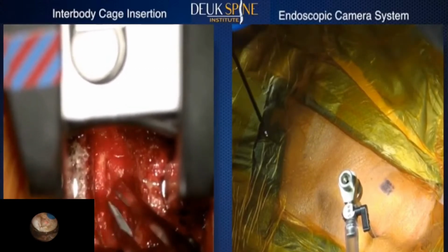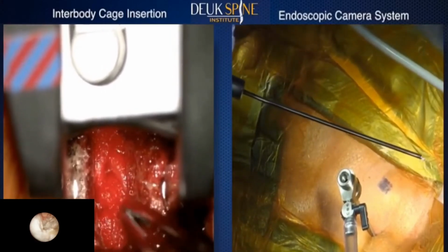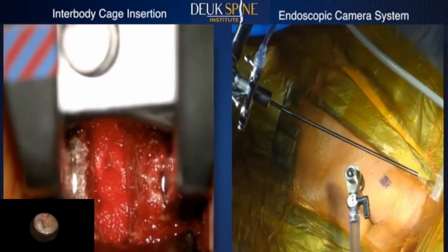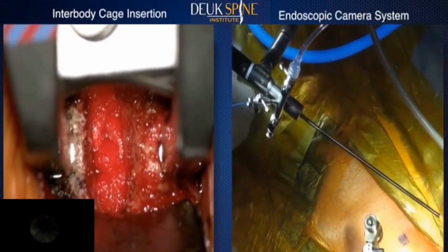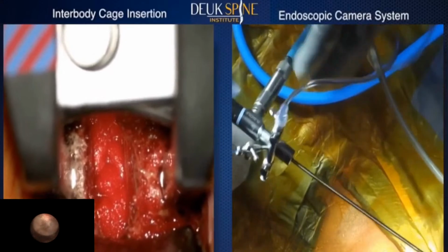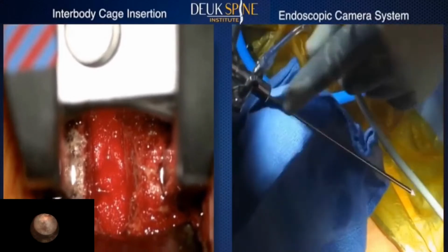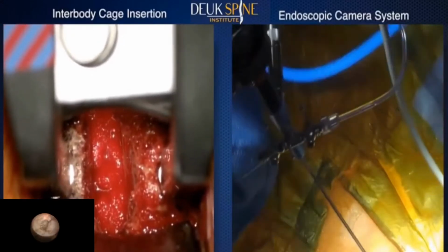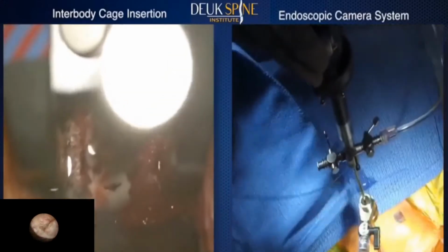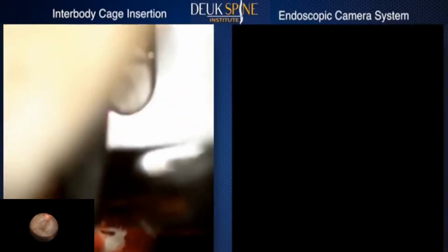The endoscope camera is inserted into the tubular retractor to allow the surgeon to guide the laser inside each symptomatic disc. The fiber optic laser used in the Deuk laser disc repair is manipulated with great accuracy to remove only painful inflammatory tissue from the disc. In this highly magnified view, the laser is used to precisely remove damaged disc material that is causing the pain. The laser is debriding, or essentially vaporizing, damaged tissue in the disc's outer layer, or annulus, specifically at the annular tear, the source of the rupture or herniation and pain.